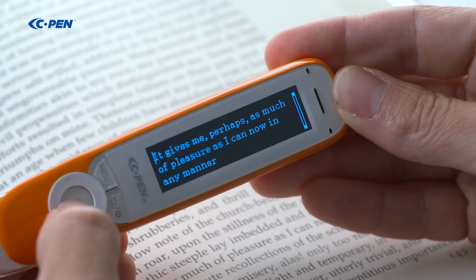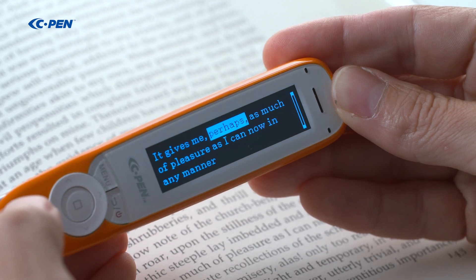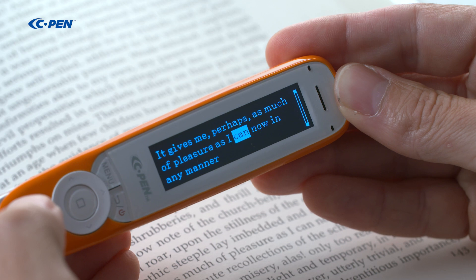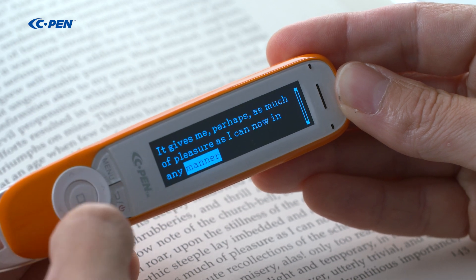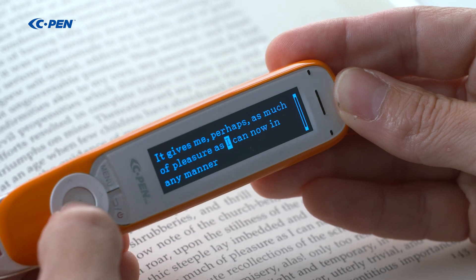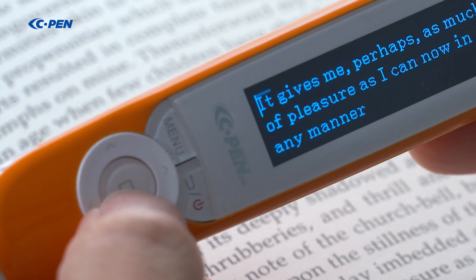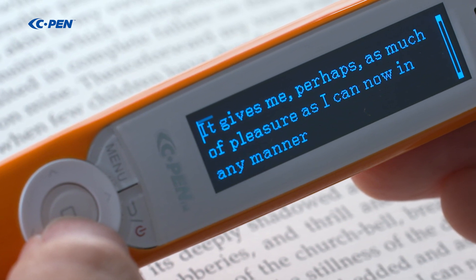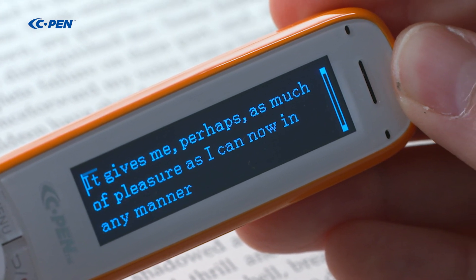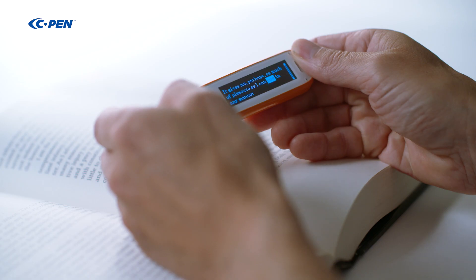Press the OK button to start reading again. To re-listen from any point, reposition the cursor and press the OK button. If any word is specifically difficult, it is possible to visually zoom in and have it separately pronounced. Select the word and press and hold the OK button.